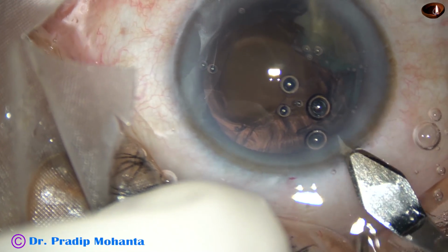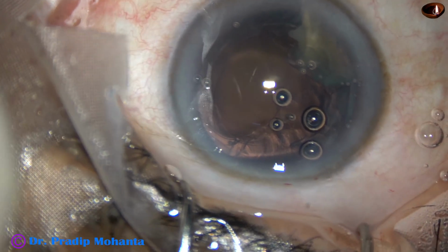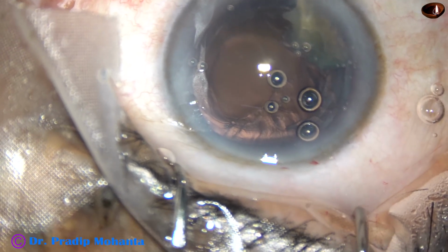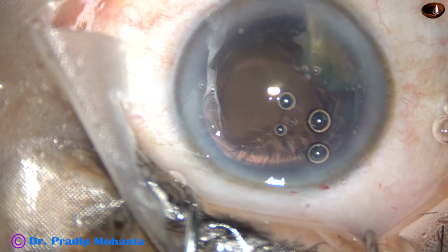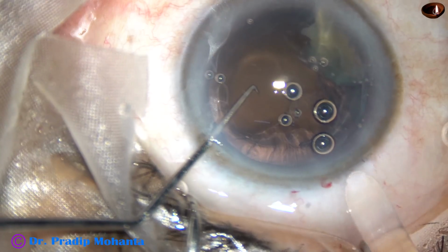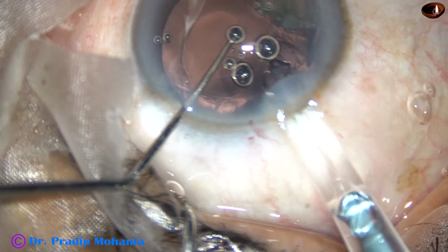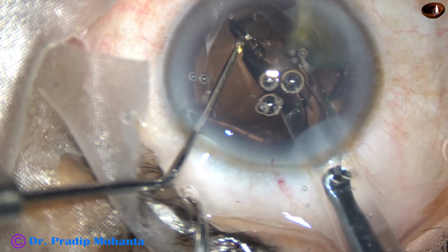And now I enlarge the main wound a little bit by 0.2 millimeter approximately, and then I implant a monofocal single piece intraocular lens in the capsular bag, and here it goes.